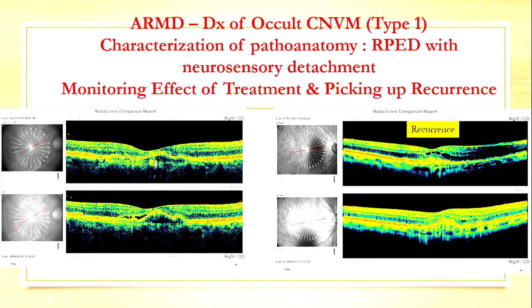Here you have an occult CNVM. You have an RPE detachment. But over here you also have, if you look carefully, a small neurosensory detachment. So it's very important when you do the OCT to go through the entire sequence of the macula — either doing rasters or radial scans, go through all the lines. Don't just see in one area. The entire area must be covered before you say there's activity or there's no activity.